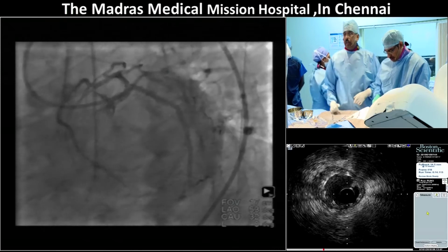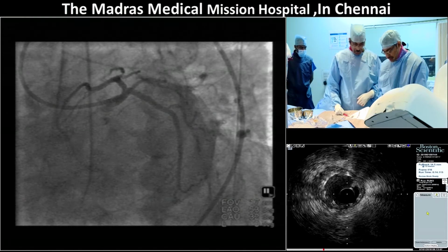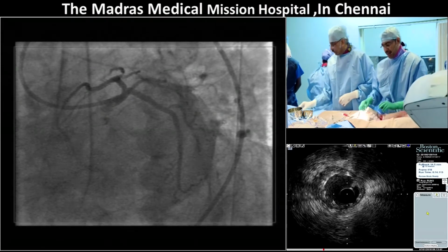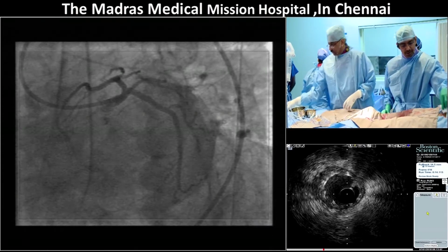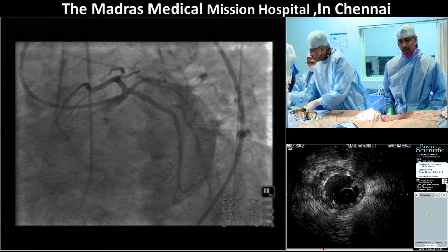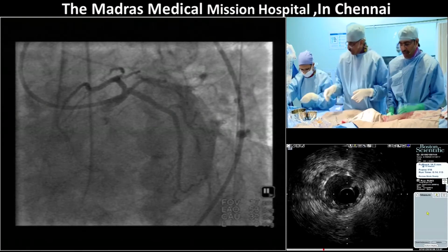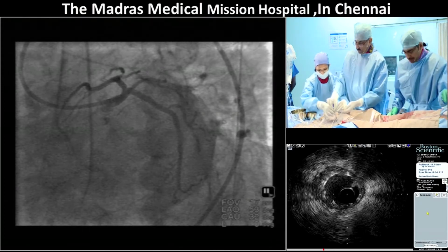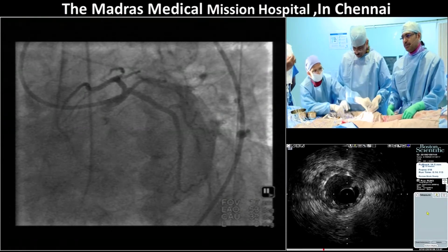Vijay, in routine cases like this, just LCX alone, I'm not talking of the RCA lesion, how often do you use IVUS in your practice now? If the patient can afford it, we want to use it in all cases, but not for type A lesions. All left mains, we use IVUS in our institute. And even a bit complex cases, particularly long lesions, we use IVUS, and calcified lesions almost always. So these are the three subsets we use it in: left main, calcified lesions, and long lesions. And whenever you have a problem, haziness or any problem angiographically, then we use IVUS. This lady, we could have done even OCT. Because the other side is a CTO, we thought we would go with IVUS.